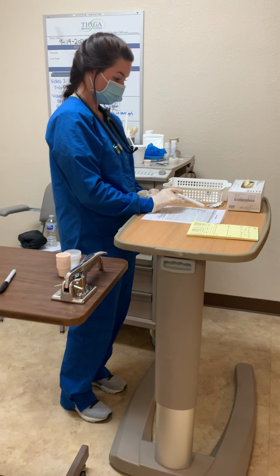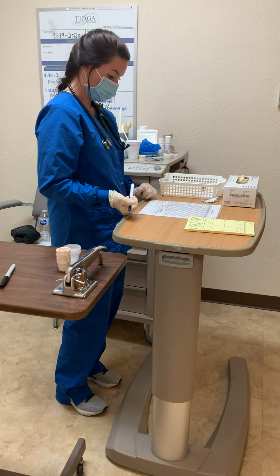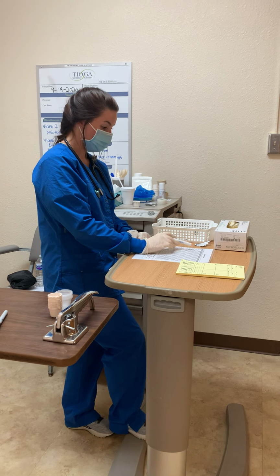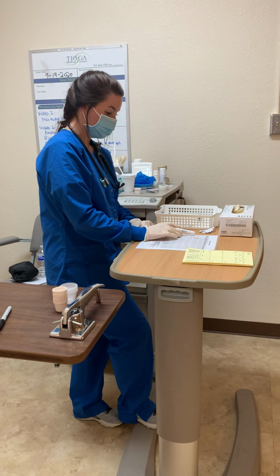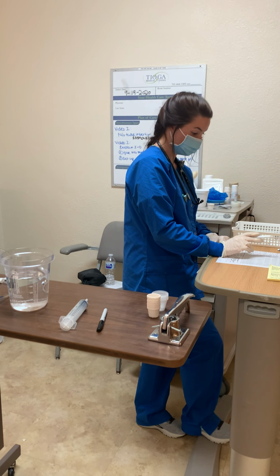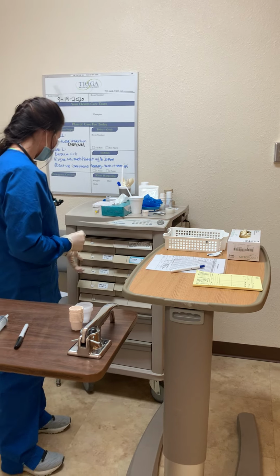So it looks like Joanne Jones, my patient, 12367, Jeff's her physician, and she's going to be getting 3 different medications that we are going to crush and give through her NG tube. So we have aspirin, 81 milligrams at 8 a.m. We have acetaminophen, 500 milligrams at 8 a.m. And we have Lasix, 20 milligrams at 8 a.m. as well. So we're going to get those out here at her drawer.